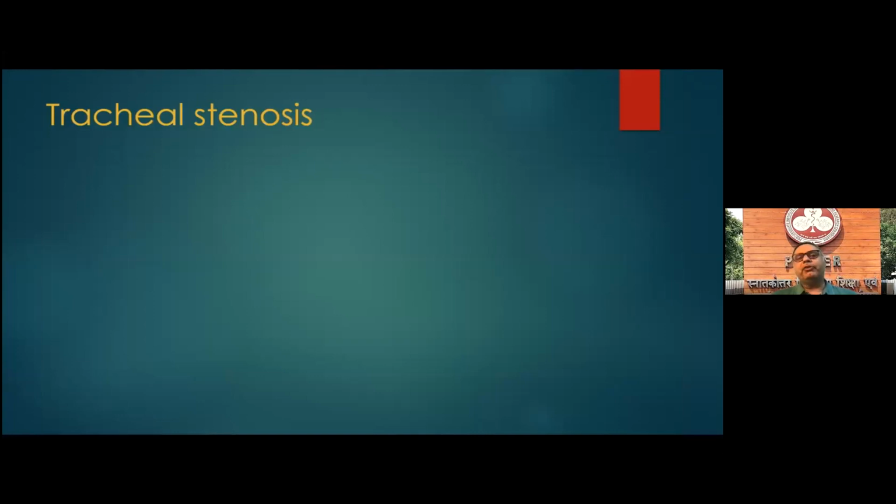The other thing which we are routinely using it for is tracheal stenosis. Now, Dr. Alok has already spoken on lasers in tracheal stenosis. Doug spoke on the balloon. Like all of them said, all these are tools. They will make it easier for you to operate, but patient selection is most important. If you think you have a grade 4 stenosis and you're going to do a laser or a balloon or a coblation, and it is suddenly going to disappear, you are going to be disappointed. So patient selection has to be appropriate, and tools are available depending upon what the surgeon is comfortable with.